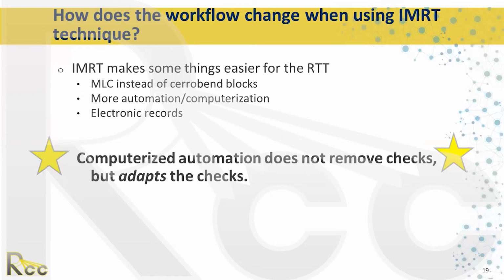And then also, I'm not sure who's using cassette films versus IGRT, but it's a lot easier to everyday film with OBI or MV panels, where you can reconfirm and make sure that you're on the correct area of the body. Our job is getting a little bit less physical, but because the margins are becoming tighter because of this automated process, it's important to be just as diligent.